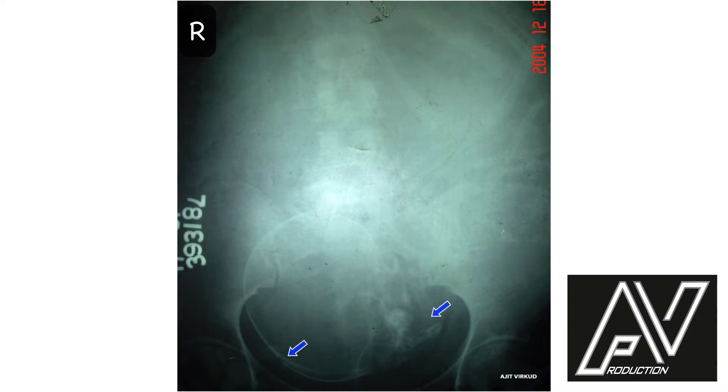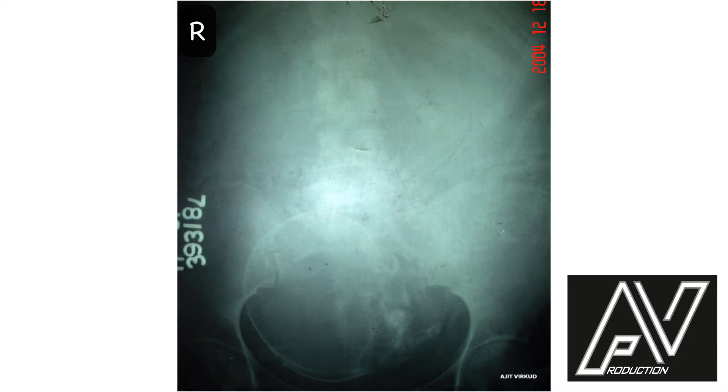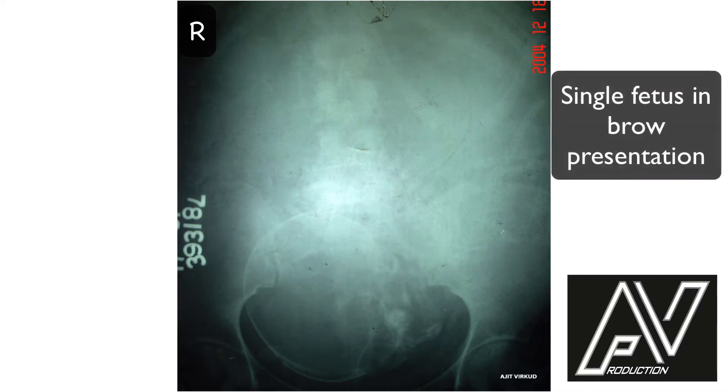This is a plain x-ray of the abdomen and pelvis, AP view, well centralized, well exposed, showing a single fetus in longitudinal lie, deflexed attitude with brow as the presenting part. There are no obvious fetal skeletal abnormalities. The presenting part is brow because the anterior fontanel is at a lower level than the mentum and the plane of the face is not perpendicular to the long axis of the vagina. Therefore, my diagnosis is single fetus in brow presentation.